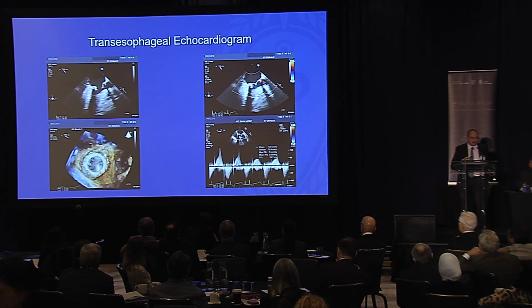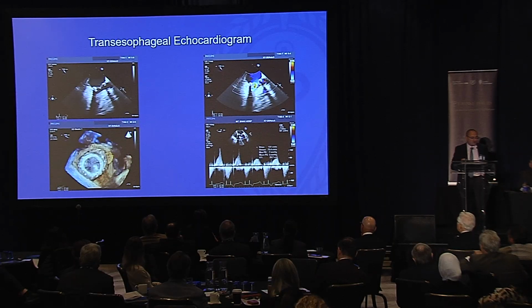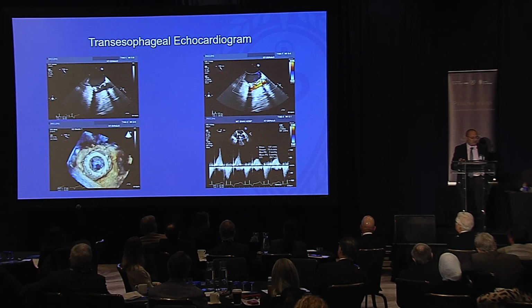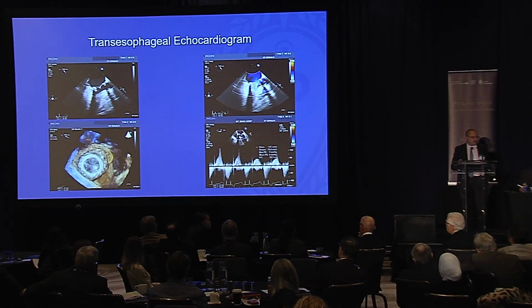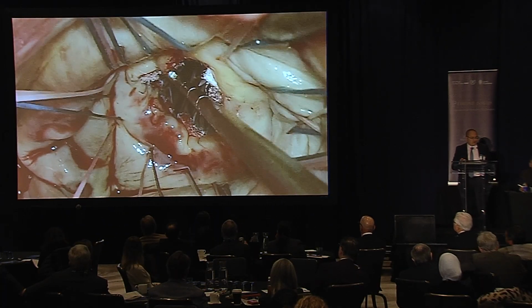Very well-seated valve, wide open outflow, no paravalvular leak or rocking. So again, a great result for otherwise a very sick patient. And that would particularly also be helpful if you have more of an anterior MAC because you get rid completely of the calcified curtain. This is another video that shows these periannular sutures.